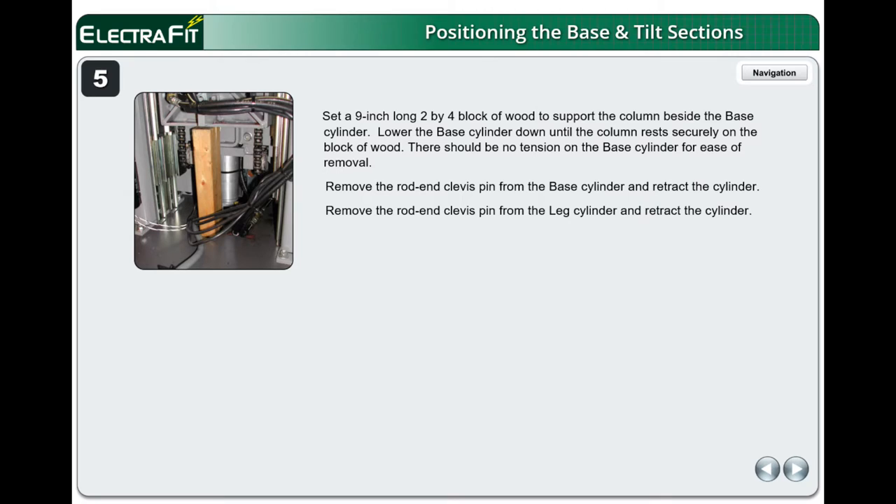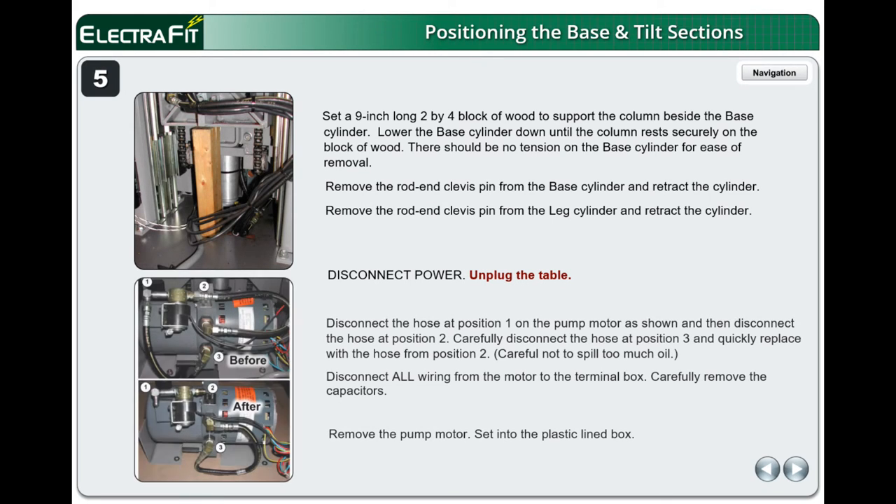Remove the rod end clevis pin from the leg cylinder and retract the cylinder. Disconnect power and unplug the table. Disconnect the hose at position 1 on the pump motor, then disconnect the hose at position 2. Carefully disconnect the hose at position 3 and quickly replace with the hose from position 2. Be careful not to spill too much oil. Disconnect all wiring from the motor to the terminal box. Carefully remove the capacitors, then remove the pump motor.